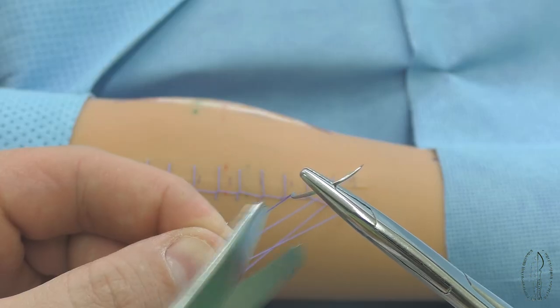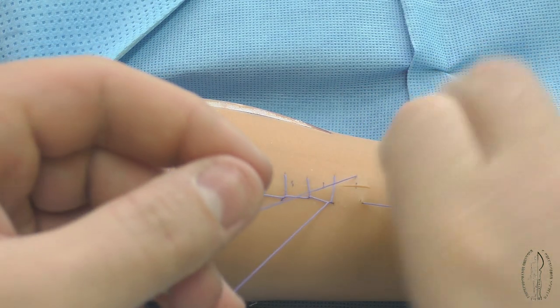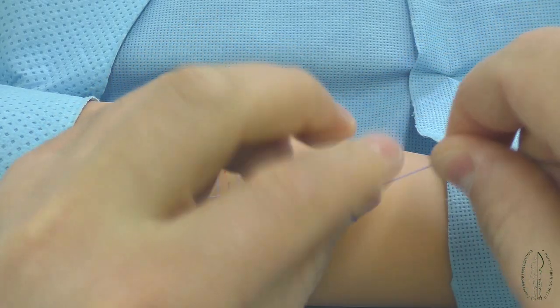The last fixing knot is made like a continuous blanket suture making technique. At the final stage, the free filament ends of the first and last knots are cut off.